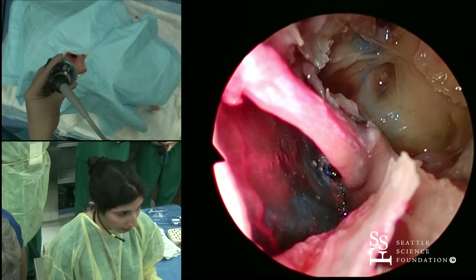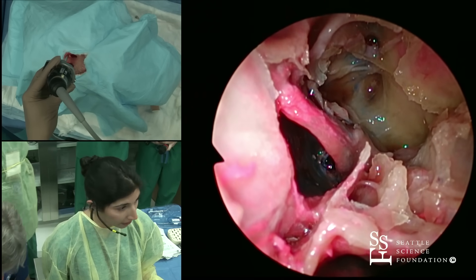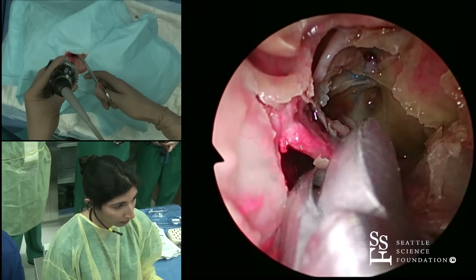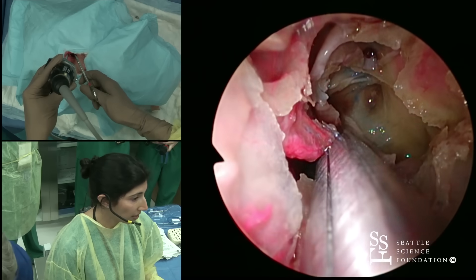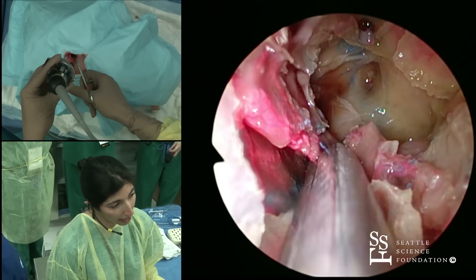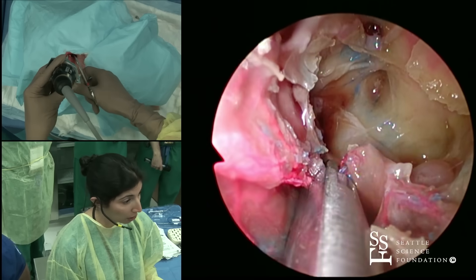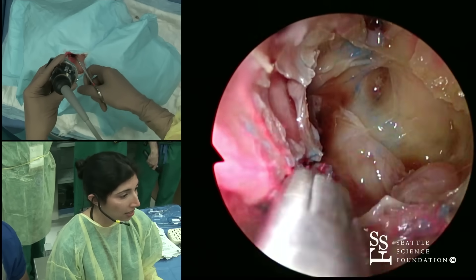I'm going to take my straight through-cut and take down that inferior portion of my superior turbinate. The question in the room was: do I always take the superior turbinate? The answer is, if I am doing this sort of trans-ethmoidal approach and I'm already taking down the ethmoids as well, then yes, this is generally what I do.